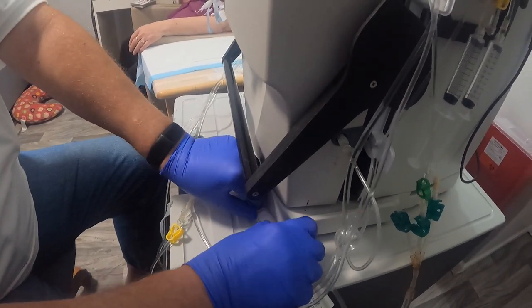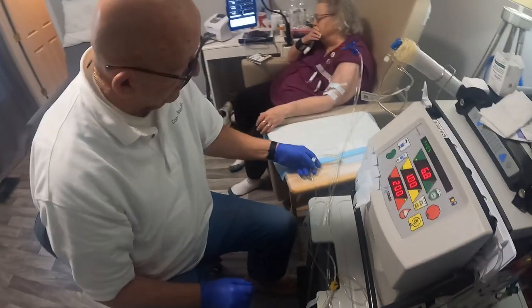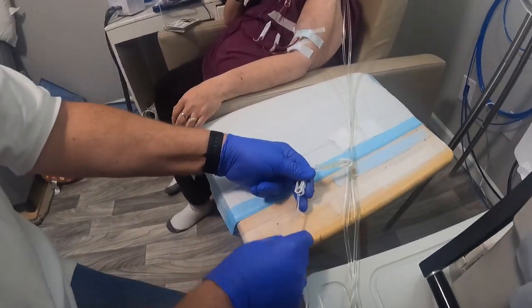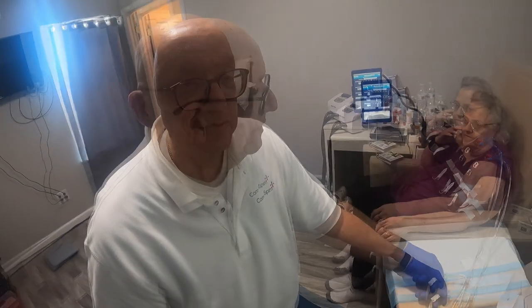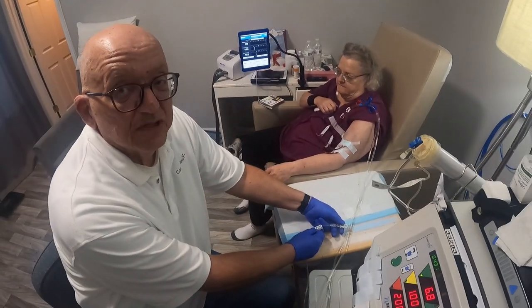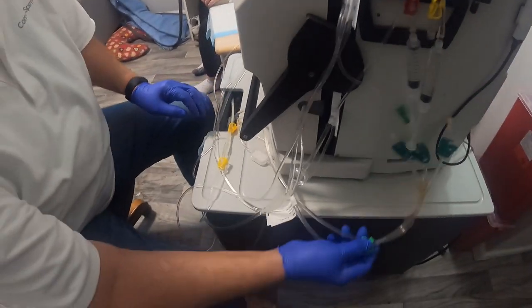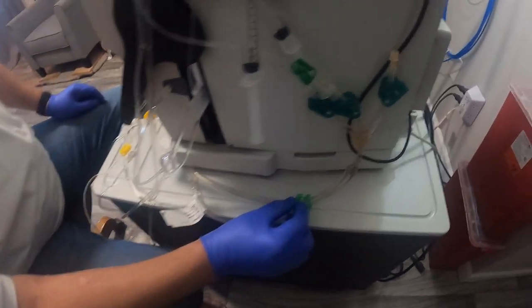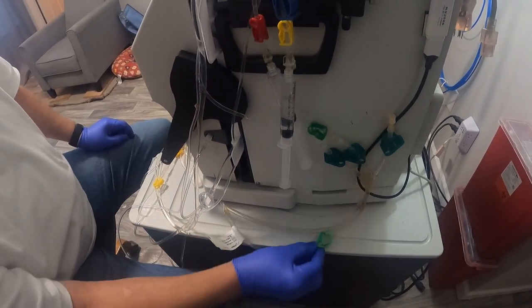And confirm all clamps are open except both saline clamps. So you got clamps here. Saline clamps must be closed. Here are your saline clamps. There's two of them. This line goes straight to the saline bag. In the event she starts passing out or something, one of the things you can do is add saline to her, and that's what these clamps are for. So they're closed because you don't want saline going in there. For now, this is a drain line. It has to be open. And these are the lines that connect everything. You open that clamp and whatever clamp the machine is hooked up to. Make sure they're all open.